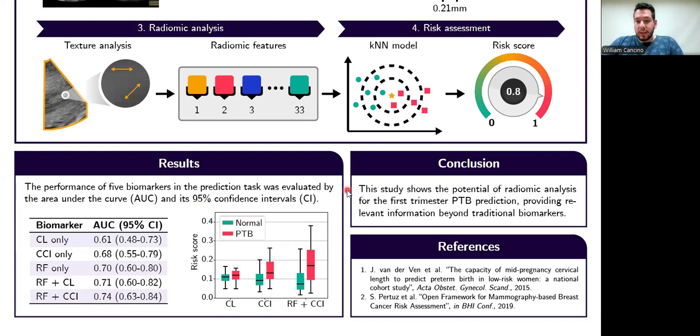So this study highlights the potential of radiomic analysis for the prediction of preterm birth in the first trimester, providing valuable information beyond traditional biomarkers. To our knowledge, this is the first work that uses radiomic analysis in transvaginal ultrasound images for PTB prediction.